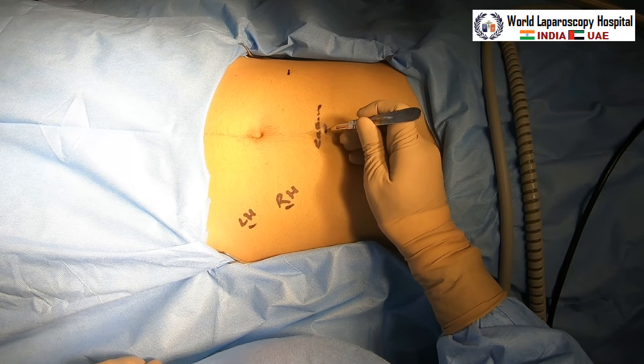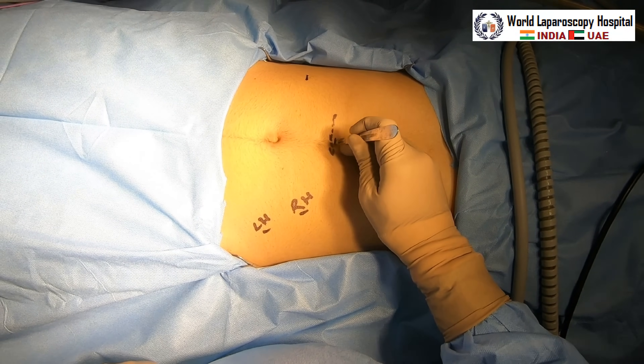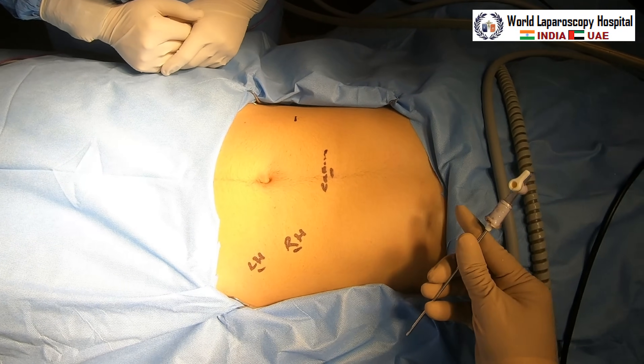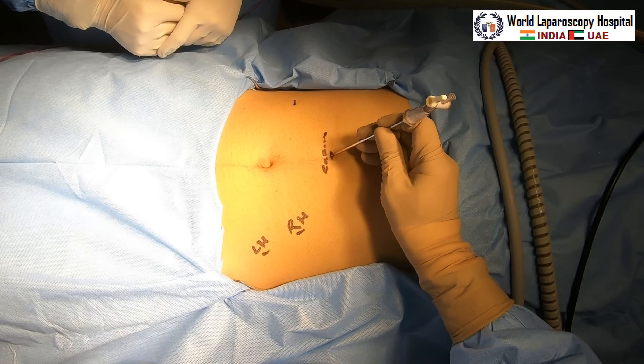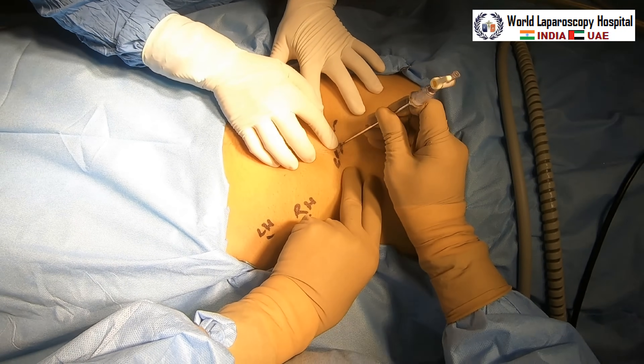For the camera port, we will place it approximately five centimeters above the umbilicus, although you can also use the umbilicus itself because it's not a very large trophoblast. The beta-hCG is 15,000 international units and it's already ruptured, so blood is collecting.